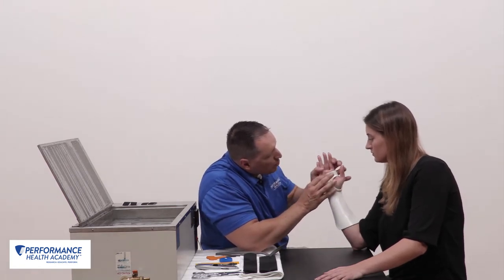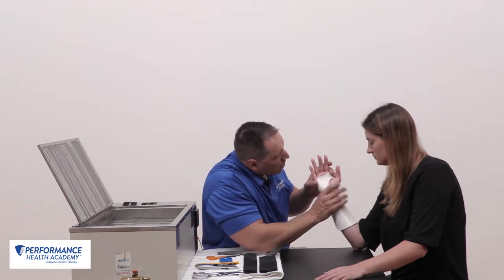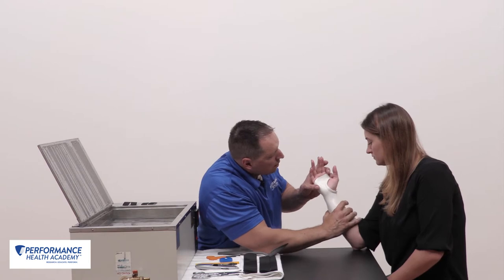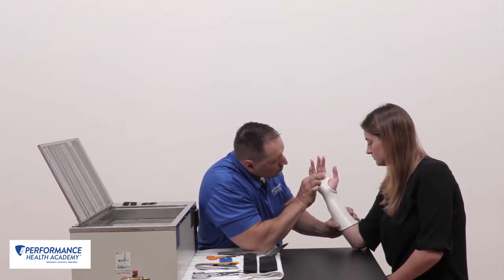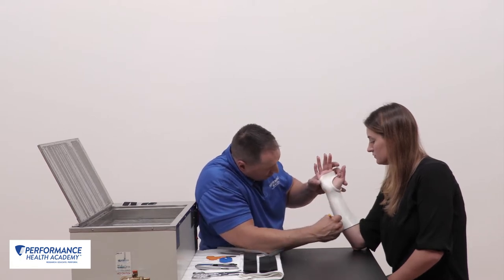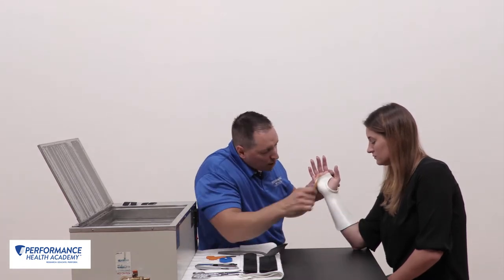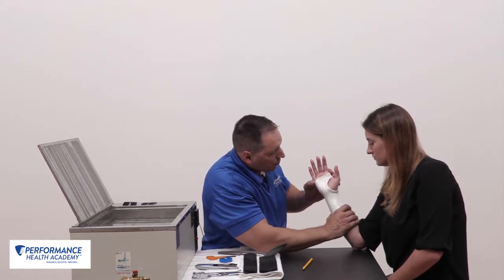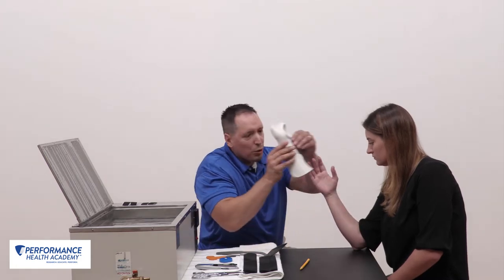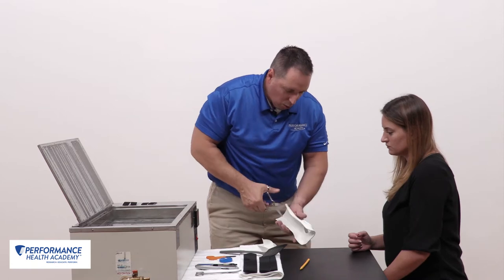This is a material where you might need more rigid support. It has great conformability but not very good memory. It could be used for a sample case like a distal radius fracture coming out after an open reduction internal fixation. I'll use my grease marker to mark out key points I need to trim and also mark where I want to place my Velcro. At this point the material is almost hard enough to trim, so I'll pull it off and cut down the orthosis while it's still soft enough to move.